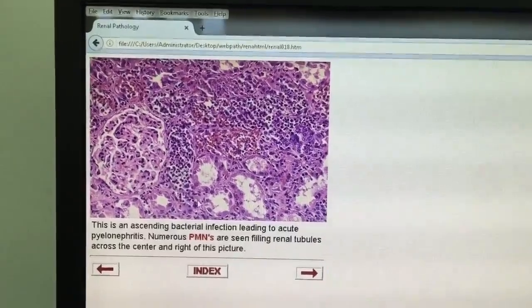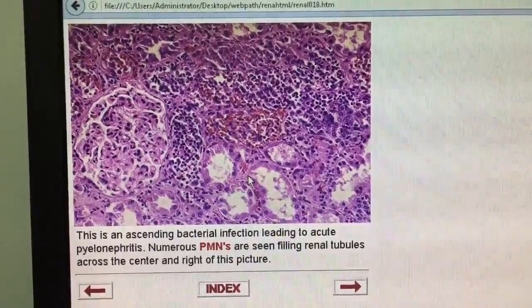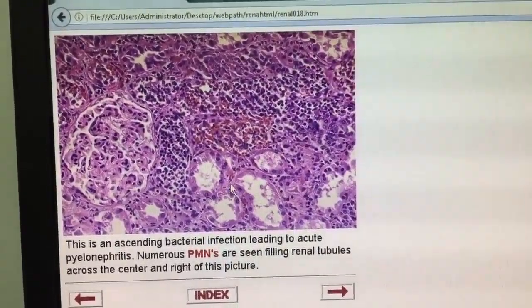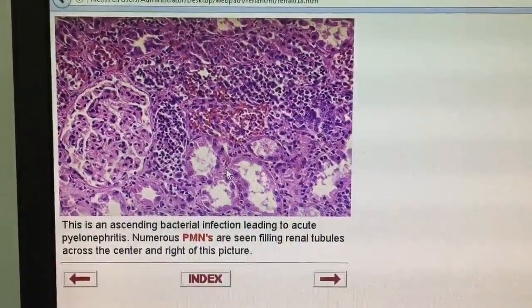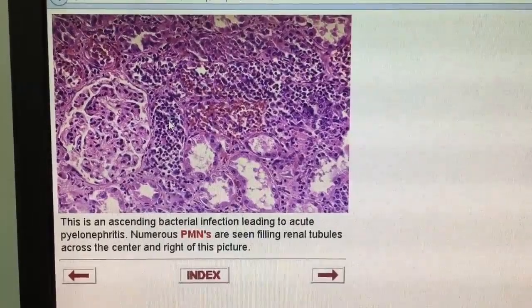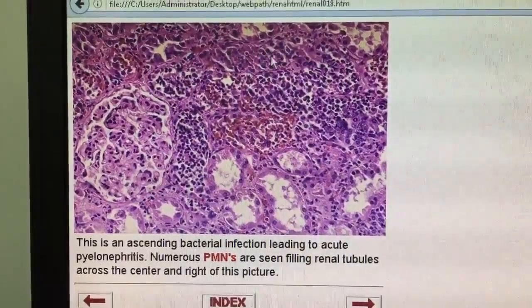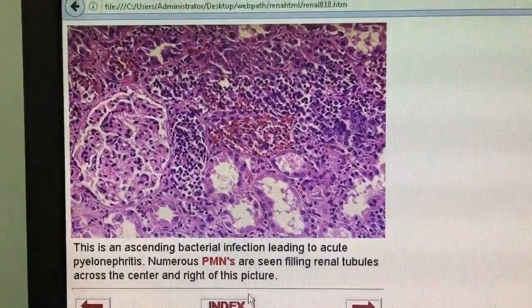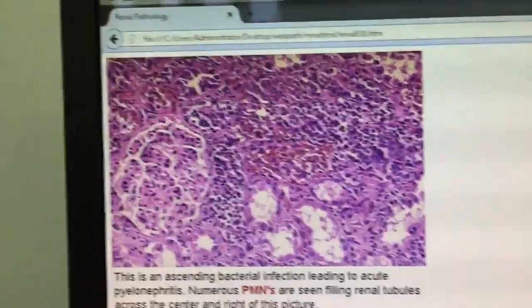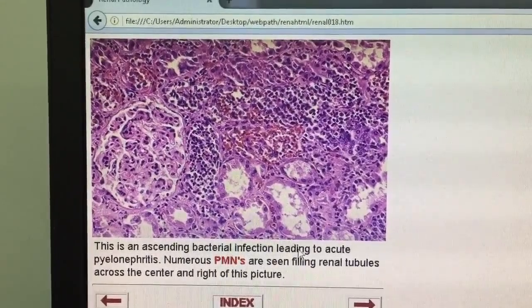First slide today, representing acute pyelonephritis, which is acute inflammation of the renal parenchyma. It is characterized by acute inflammatory cellular infiltrate within the renal tubules and intervening renal parenchyma. The predominant inflammatory cells present in this type are the neutrophils. Also, congestion and edema are present.